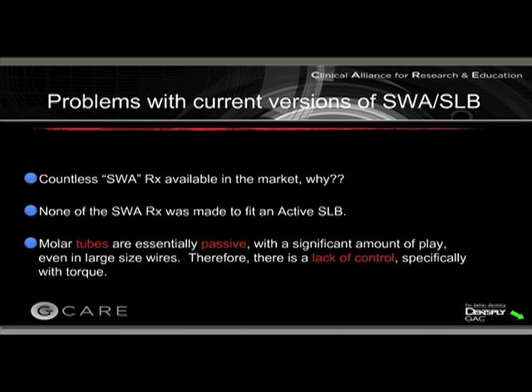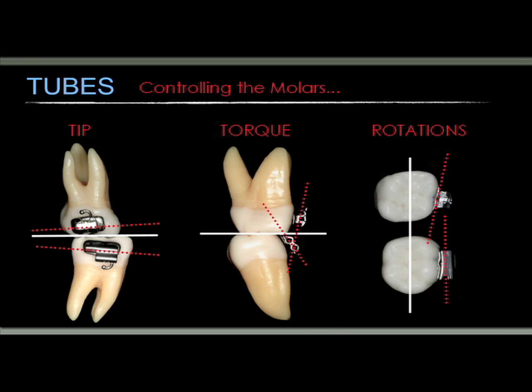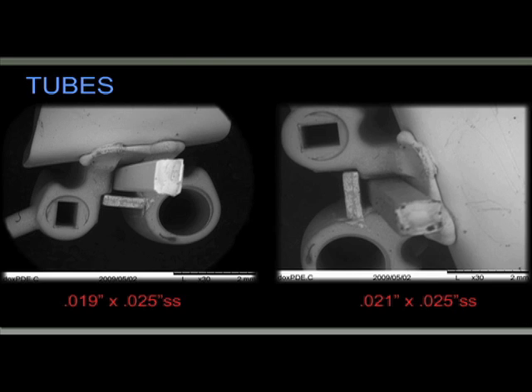There's nothing really pushing the wire against the slot on a tube, and that is very important because we have realized now that there is a significant amount of play, even with large arch wires, in the molar tubes, and we know that means we have a lot of lack of control, specifically with torque. Torque is very difficult to express in tubes. As you can see in this slide, with the tubes we can control tip, torque, and rotations of the molars.